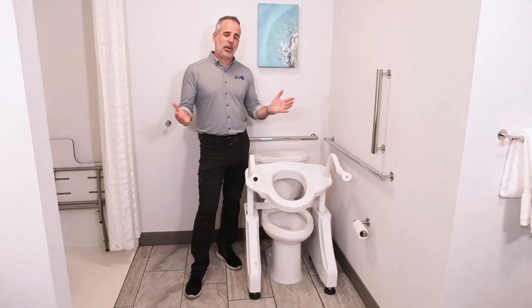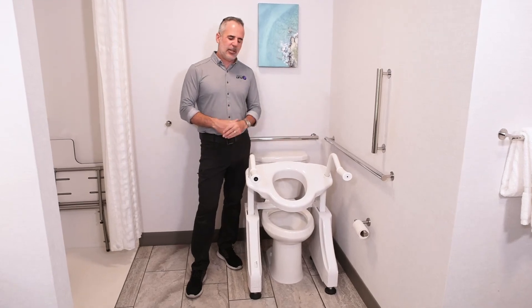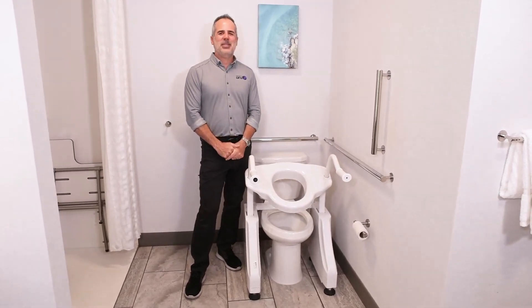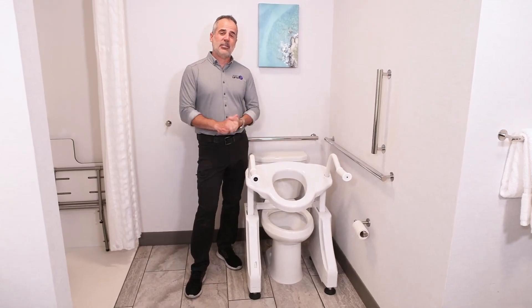We're Dignity Lifts. You can find our products at DignityLifts.com. This is the DL1, our Deluxe Toilet Lift, and you'll find it on our website DignityLifts.com and at all our dealers nationwide.